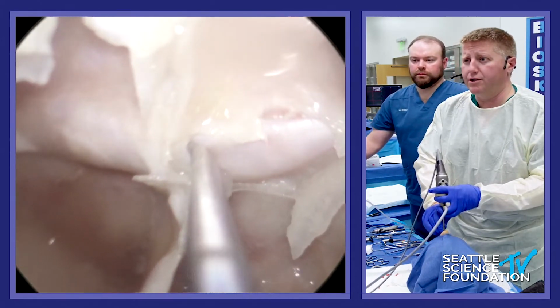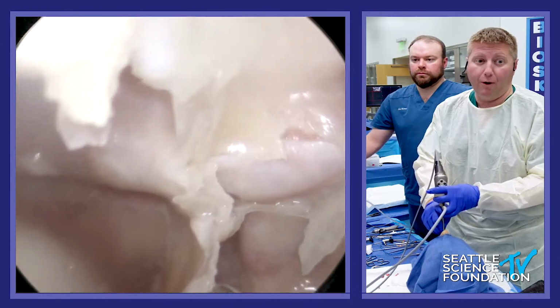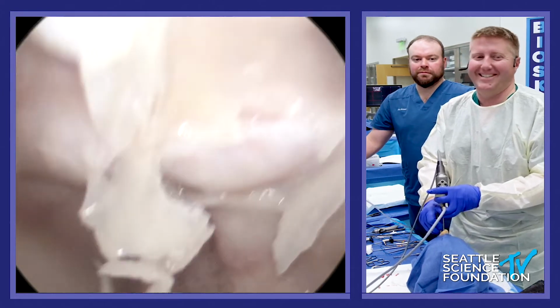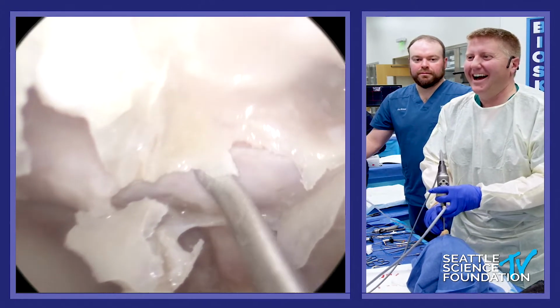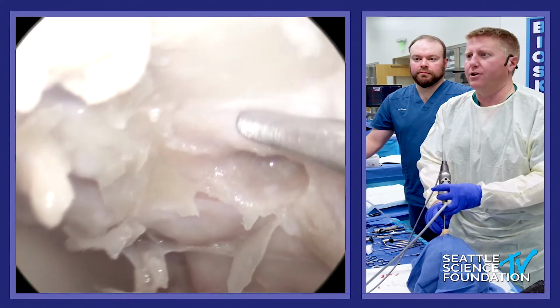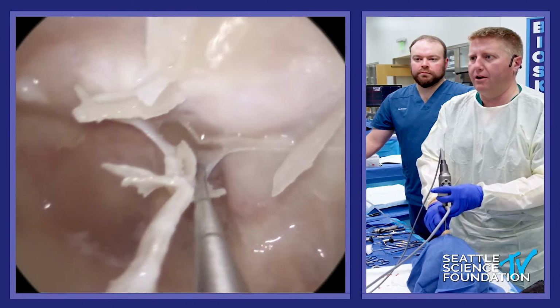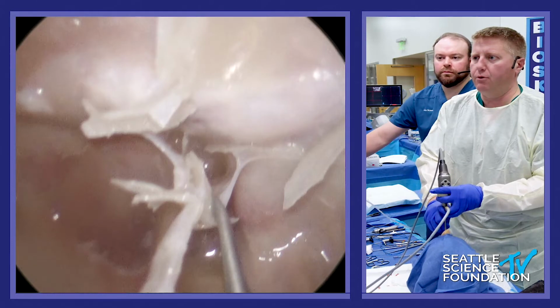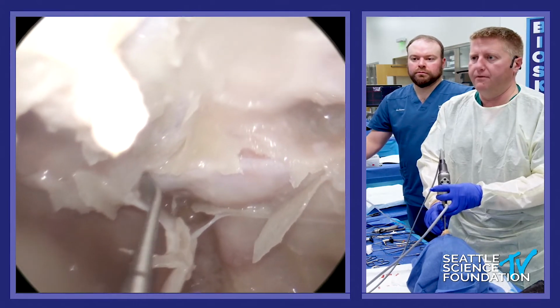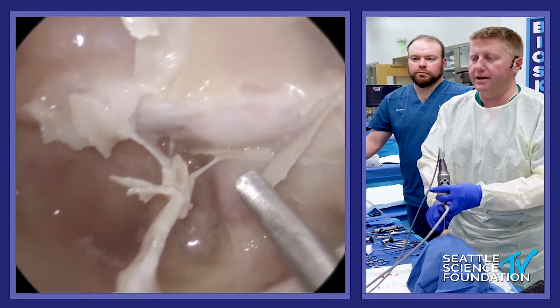One of the things you don't want to do is what I'm doing right now, which is pulling bone away. Brad looks concerned over there by this. Because, look where we are. Again, to orient, optic nerve, carotid artery, we're right here. So we want to get through all this. You want to make all these moves very specific, very deliberate, using cutting instruments. You don't want to be picking stuff off or things like that.